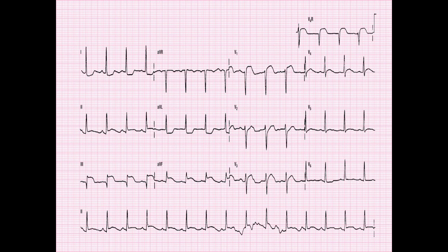Well, are we gambling on that one singular window catching that right ventricular infarction? Well, no, we can move all three windows. Let's put more windows on that right ventricle. Let's do V4R, V5R, and V6R. So just don't do one, do all three, and get a good view of that right ventricle.